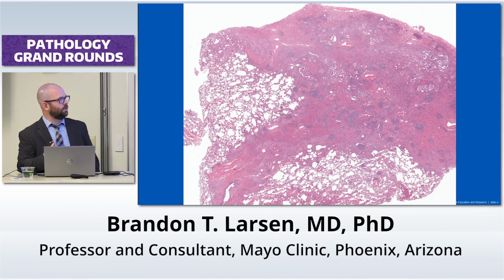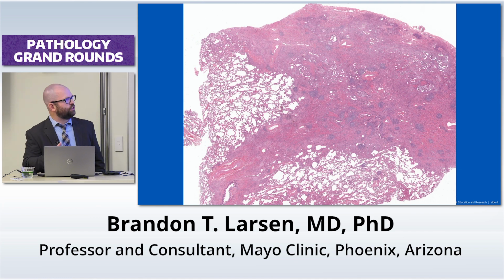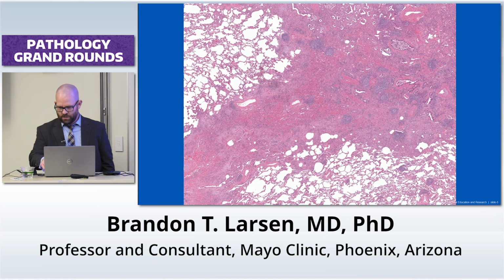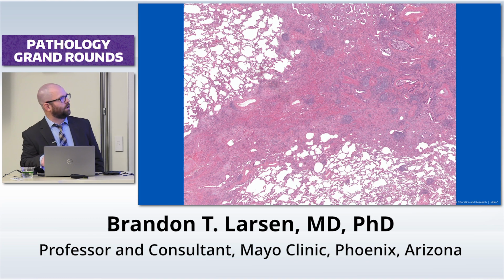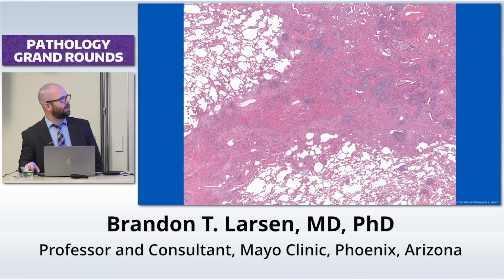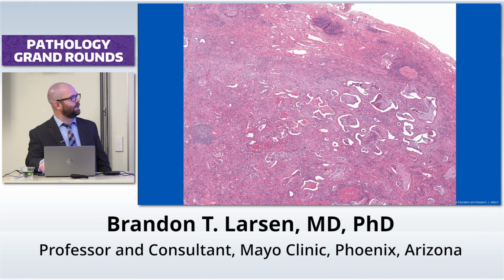So here at low magnification, we can clearly see this is abnormal lung tissue. There's probably something fibrotic going on. It's quite heterogeneous. There are quite a few lymphoid aggregates here. We come in a little bit closer. You can see numerous lymphoid aggregates in the fibrotic process, some with germinal centers, but you can also see these paler areas of active fibroblastic proliferation at the periphery of the fibrosis at the interface with the adjacent uninvolved lung, so-called fibroblast foci.